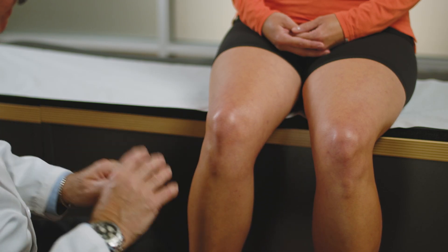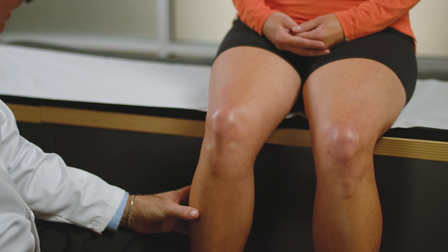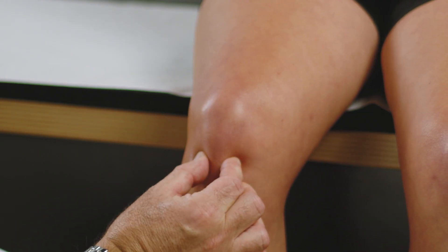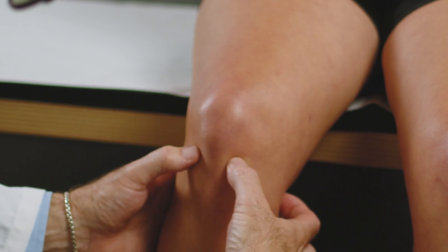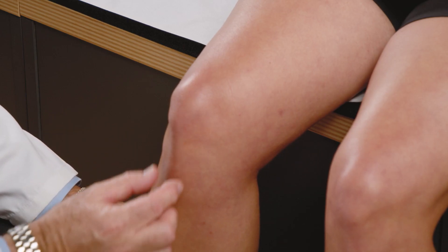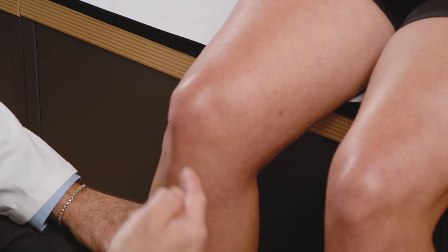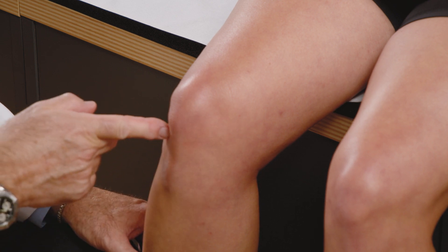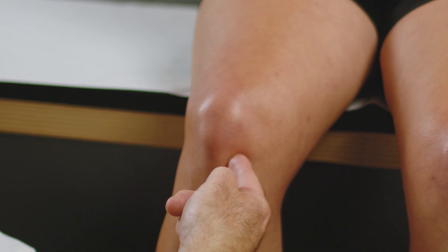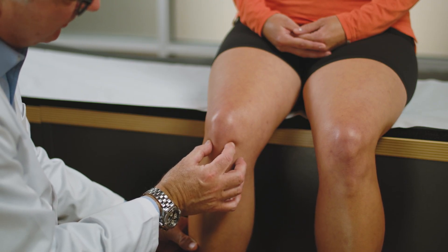Typically when the patient is sitting like this you would be doing the inferomedial or inferolateral routes, and this would be used in a larger patient where it's very difficult to do one of the upper routes. So to do that we identify the patellar tendon, the joint line, and then we can mark either side of it where we can do that injection. The really important thing here is to avoid a fat pad called Hoffa's fat pad, which lies directly behind the patellar tendon. When injecting, you don't want to go inwards on either side — it has to be straight back and then you will miss that fat pad. Avoiding the fat pad is really important because it is full of nerve endings, and if you inject into it then the patient will have side effects relating to that.